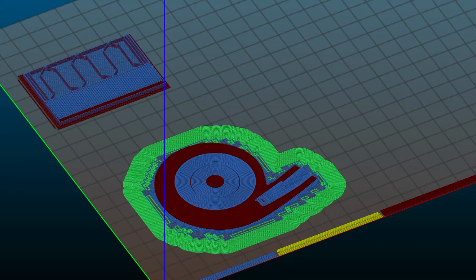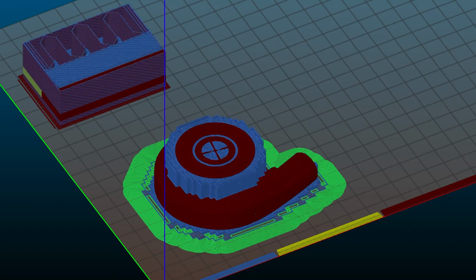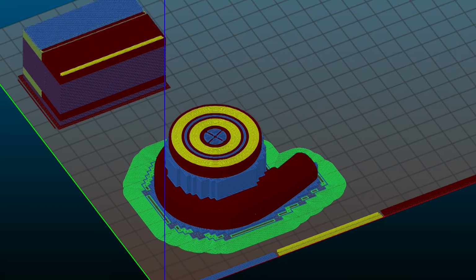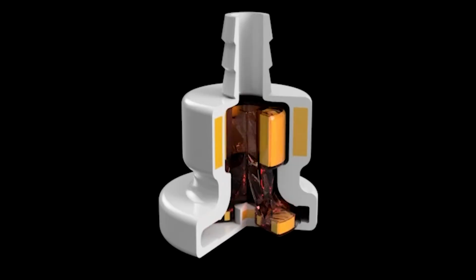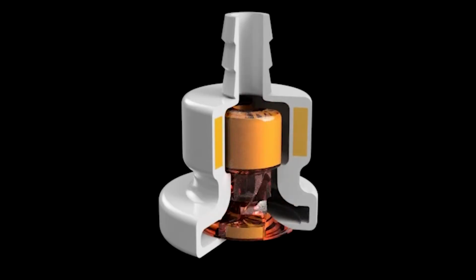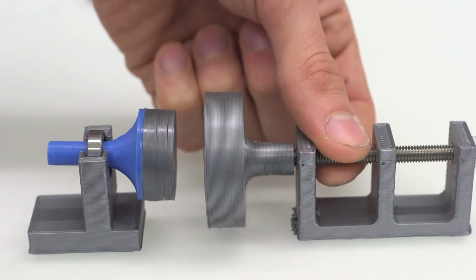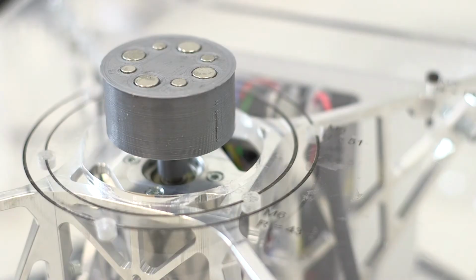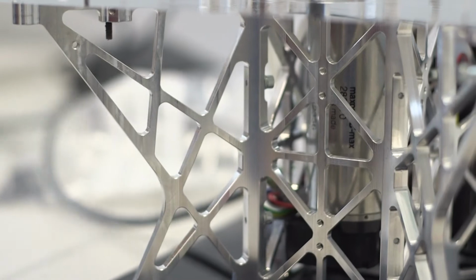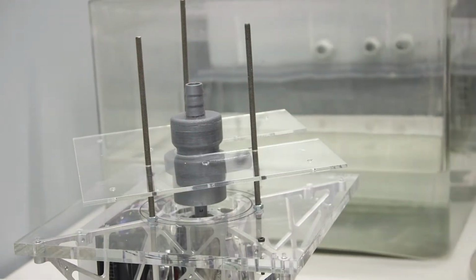Using this new process, we printed a pump demonstrator in one single print job. It has 10 integrated components: the housing, the impeller, 4 magnets for 2 radial magnetic bearings, and 4 magnets fitted into the blade shape for driving the impeller by magnetic coupling. To actuate this prototype system, we use magnetic coupling with strong permanent magnets spinning on a servo motor. This approach will be replaced in the future by stator coils attached to the bottom of the housing.